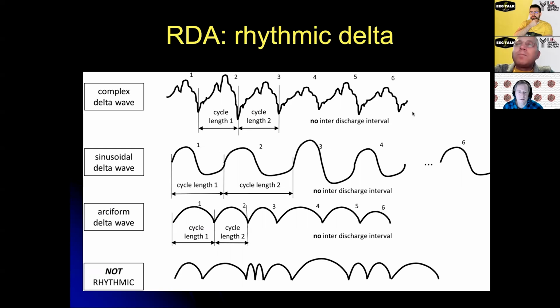If it's perfectly regular for an entire page or more, you got to worry that that's actually machine artifact of some kind. Yeah, like a demon trying to make you call the wrong thing. Yeah, the old demon artifact. That's a tough one to identify. Maxwell's demon. All right, let's see what's next.